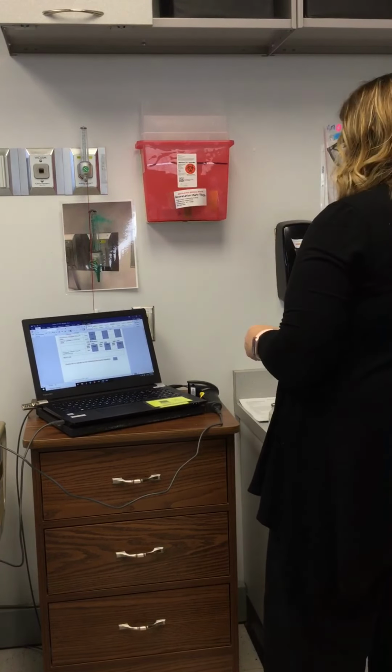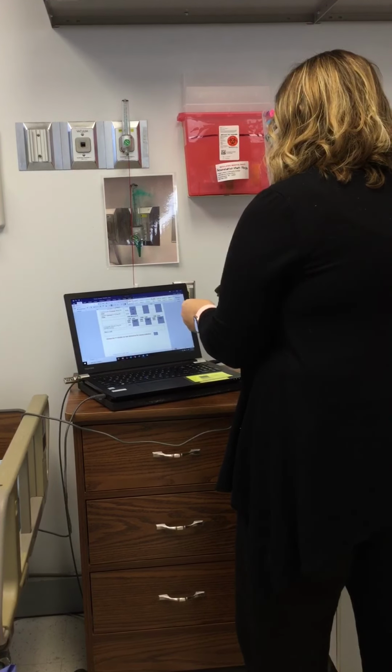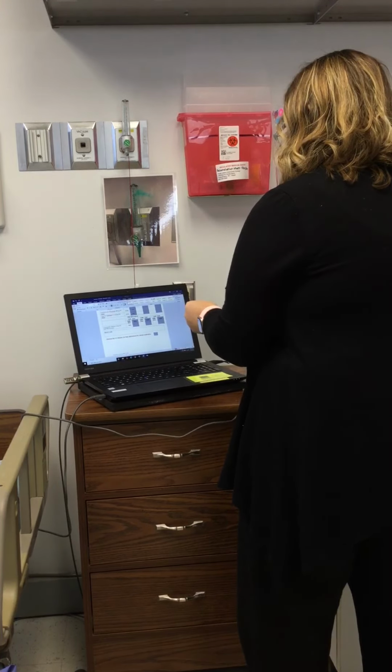Next I have my lorazepam, 2 milligrams PO. It's due at 0600. They have not had a dose in the last 4 hours. It's not expired, and the barcode is good. Okay, and we'll pretend that one beeped. Alright. So I have now scanned all my medications.